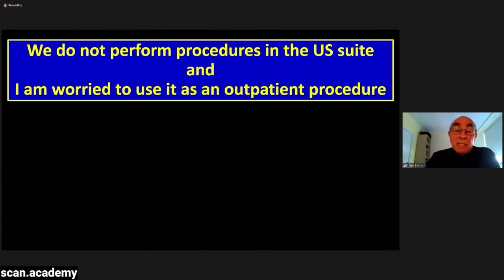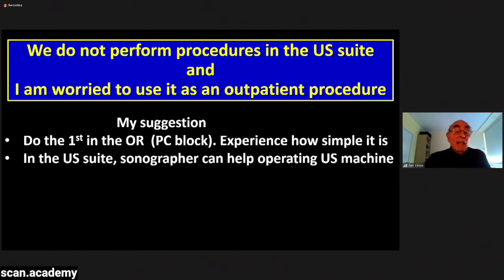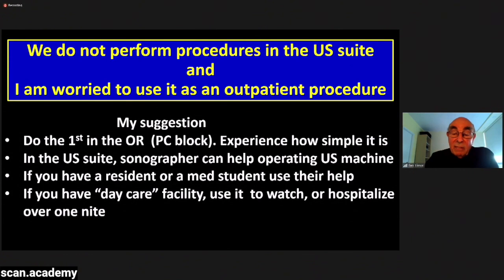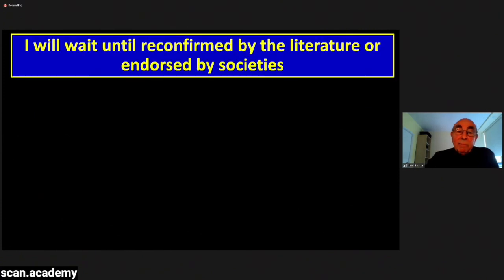We do not perform this in the ultrasound units. I'm worried to use it as an outpatient. Well, my suggestion here is do it in the OR, paracervical block, experience how simple it is. In the ultrasound suite, the sonographer can help operating the machine. We do it only in the ultrasound suite. If you have a resident or a medical student, use their help. If you have a daycare facility, use it to watch or hospitalized over one night, and then maybe later you can use it as a one-day procedure. Or again, call me but during the daytime, please.